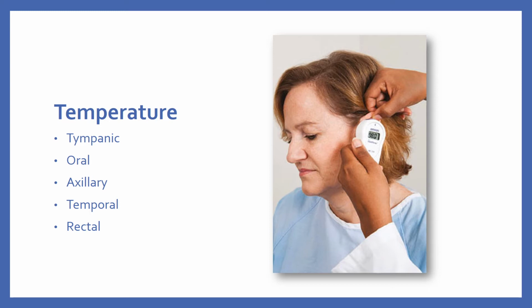Just like the oral and axillary electronic thermometers, you'll hear a beep, and a red light will blink to indicate a measurement is taking place. Release the scan button, and then you want to release the thermometer from the forehead. The temporal artery temperature is approximately 0.4 degrees Celsius higher than the axillary. Normal temporal artery temperature range is 36.3 to 37.9 degrees Celsius, or 97.4 to 100.3 degrees Fahrenheit.